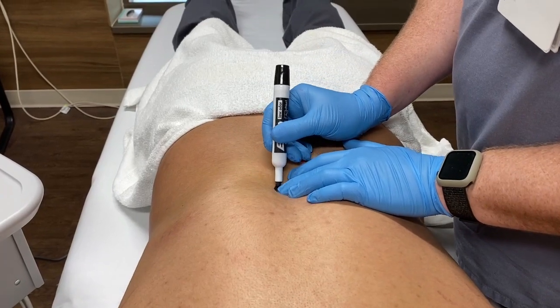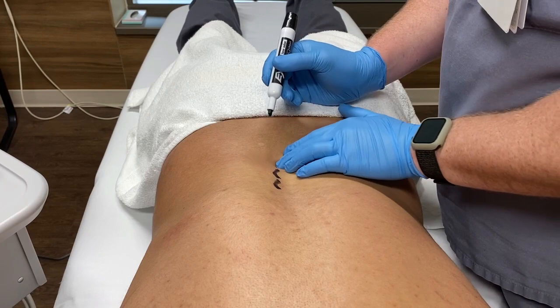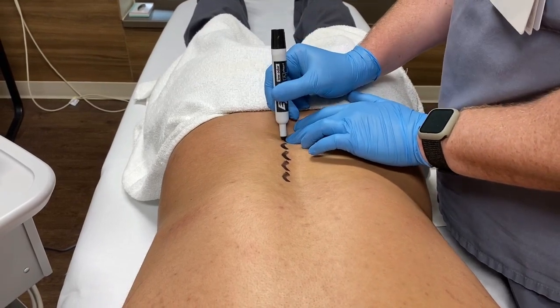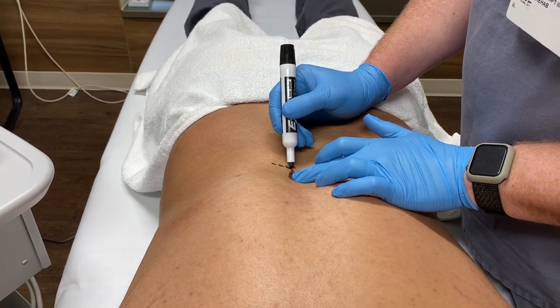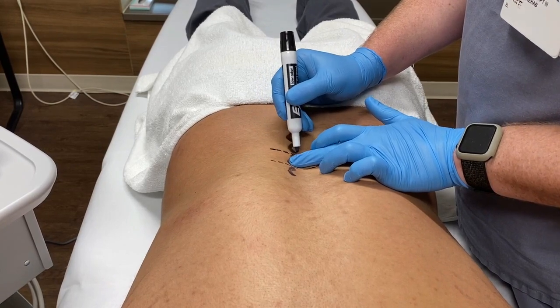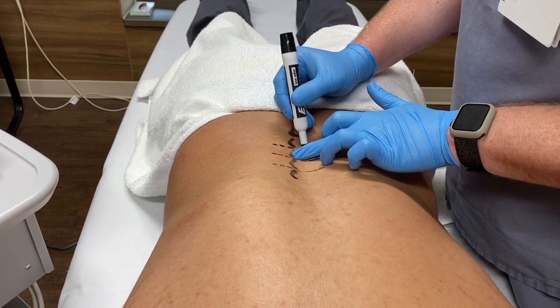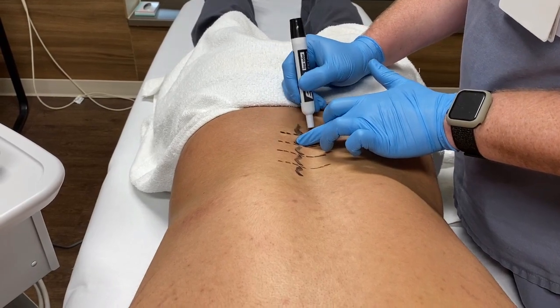To get an idea of where we're going, I like to do a little drawing first. I find the spinous process, roll my finger to the edge of it, and mark the edge of the spinous process. Then I mark the horizontal line in the space in between the spinous processes — that space is basically where I'm going to insert the needle to go in between the transverse processes. Marking that line will help me find it more easily while using ultrasound.